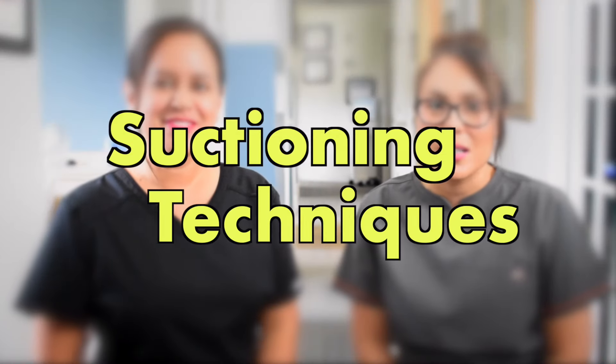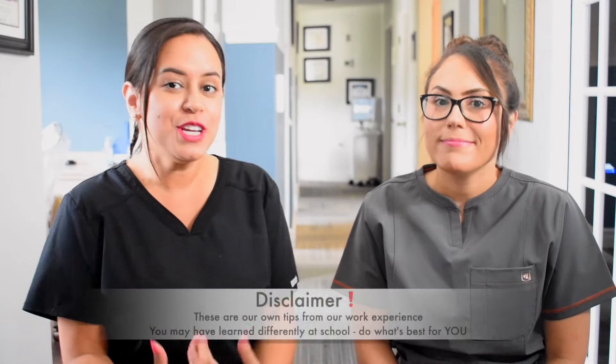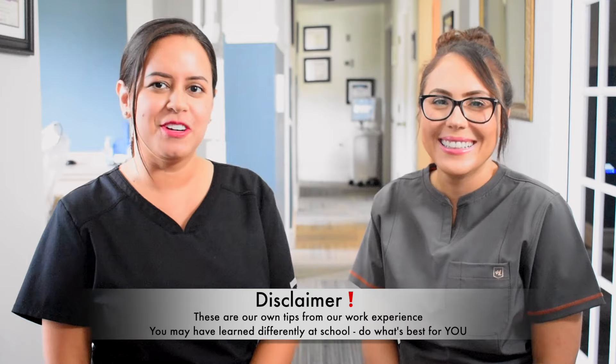Today's video is going to be super short, straight to the point. You guys have been requesting this a lot — requesting for us to do a video on suctioning techniques. So we're basically going to show you how we do it. Let's get back into the operatory.